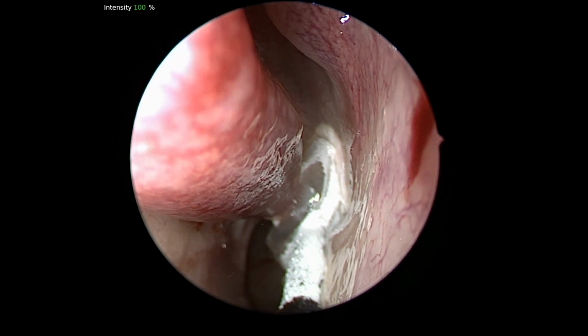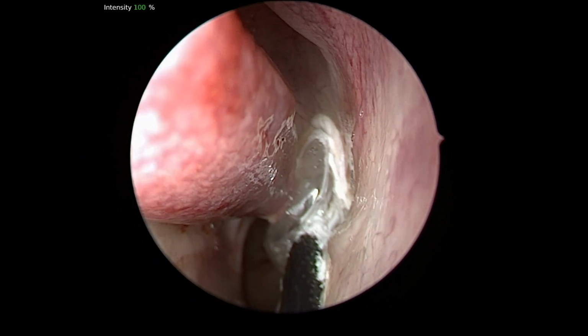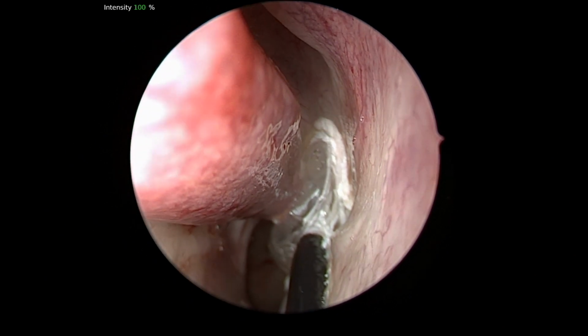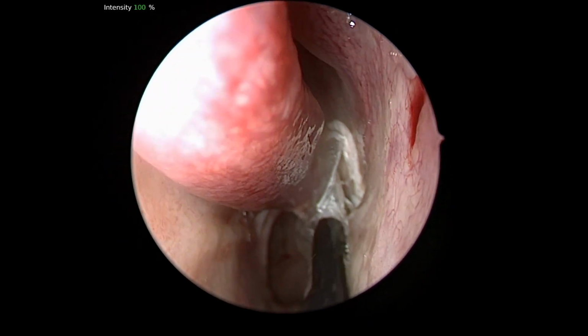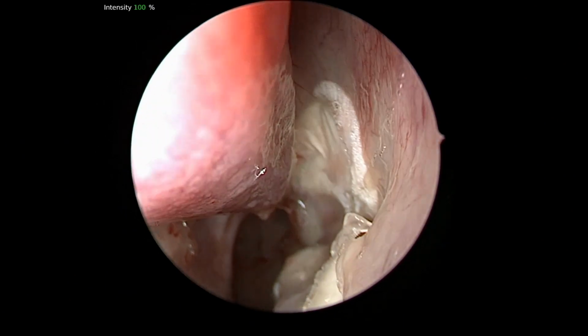After the end of 30 seconds, we are going to have the patient breathe through their nose. This allows warm exhaled air to facilitate the defrosting of the balloon. We should only try and remove the balloon when it's fully defrosted and requires only minimal effort to slide it off the surface. Otherwise, we can cause trauma to the mucosa.